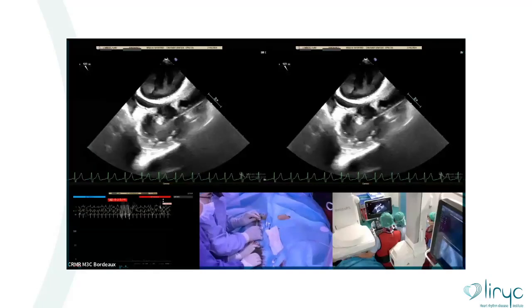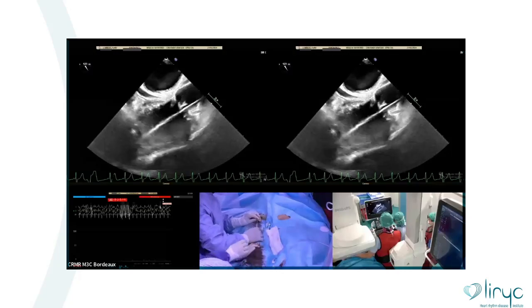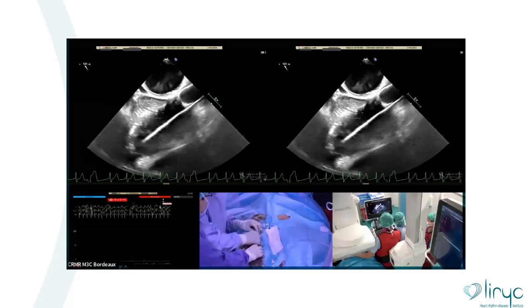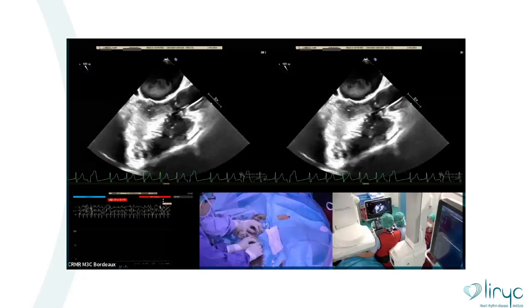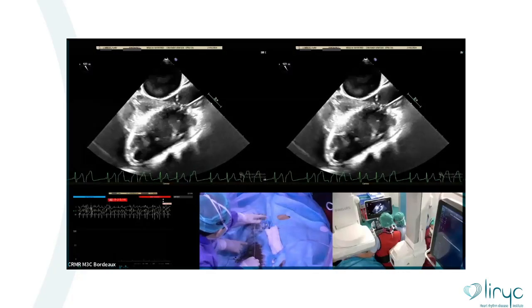I think we're fine, I think you are fine. I'm just going to pull back the dilator and leave the wire, just in case. Make it wire again. Yeah, it's okay.